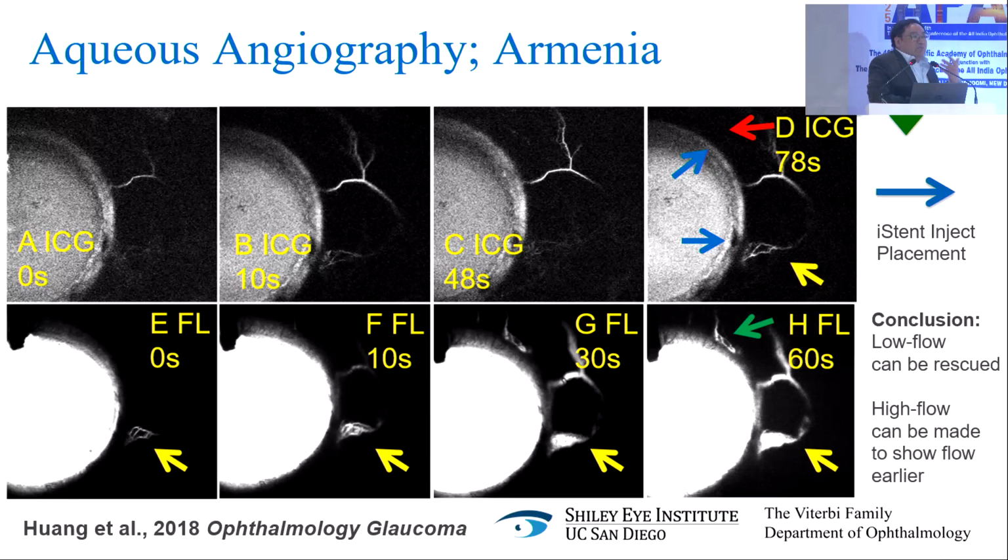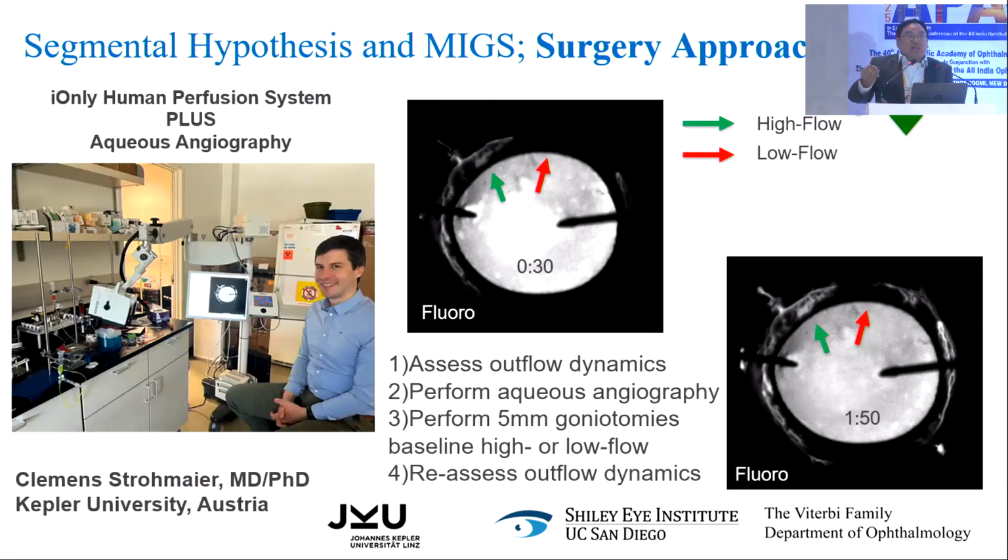And then we were left with, well, what does that mean? What does that mean for the OCT? This study was very hard to do that because we only had 14 patients, and many patients like this had 1 stent in low, 1 stent in high. How are you going to tell the difference? So we knew we had to take a step back and go back to the laboratory.